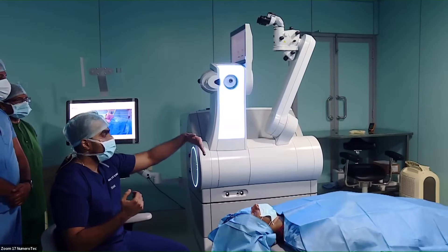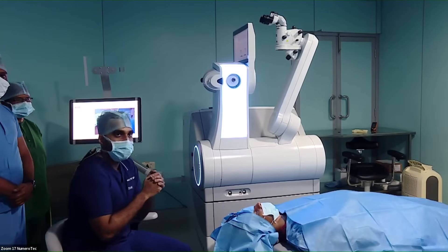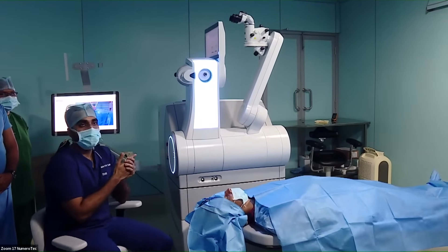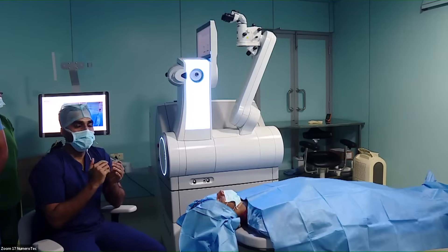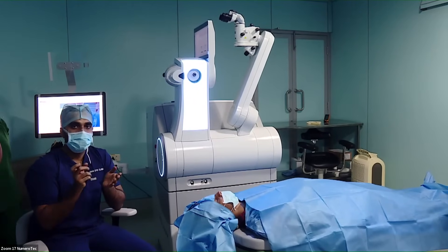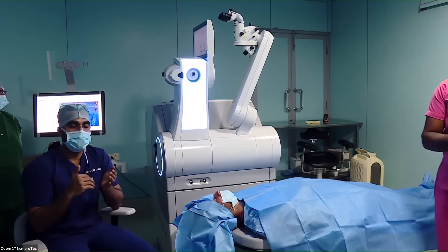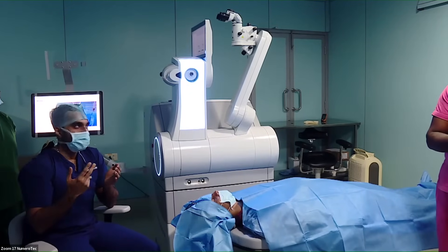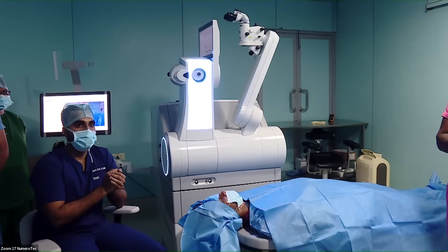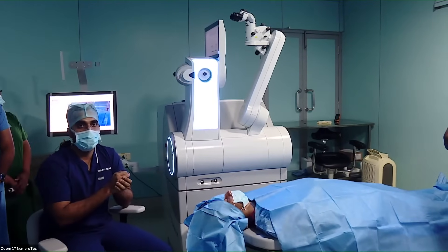What are the main differences between the Visumax 800 and the older SMILE platform? First, the laser application here is only 8 seconds, whereas in the older one it was about 22 to 30 seconds. So once the laser application time has been brought down so drastically, your chances of suction loss are also reduced. Second, they have an incorporated algorithm for cyclotorsional compensation, providing higher accuracy when treating patients with high cylinder.